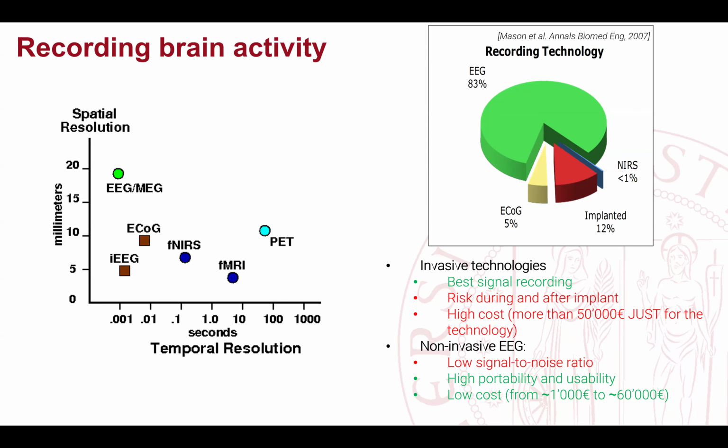Yes. And I saw that there is a company that was working with Snapchat. It's called NextMind. And what they are doing is they have a non-invasive EEG headset that will be connected to Snapchat. And when you say yes or no, it will directly. And is this speech? No, it's not speech. What they're using is modulation of the alpha wave. So if you have an electrode here, they're using the modulation of the alpha wave. So when I ask you to focus, then you will see a variation, and you associate this variation to yes. If you don't see the focus, then you associate it to no.